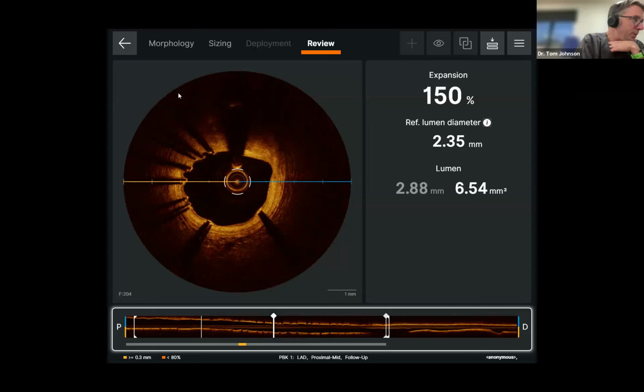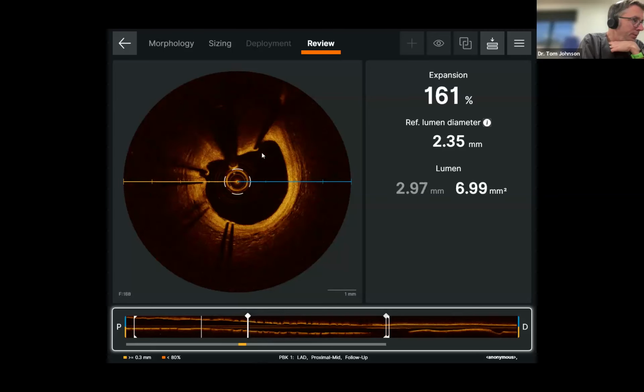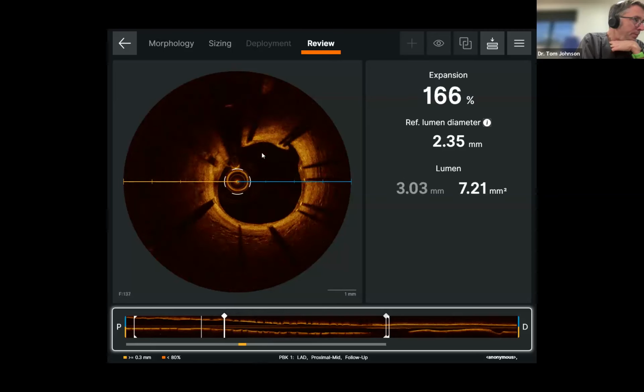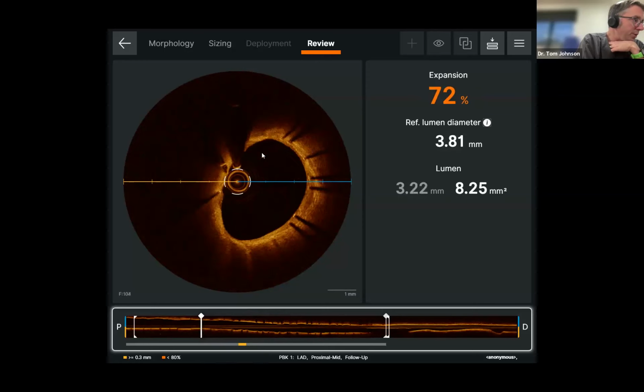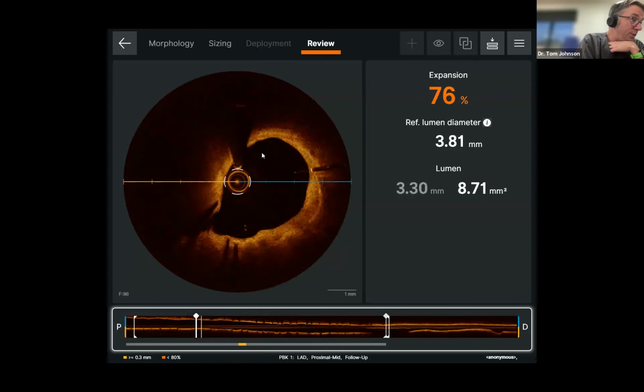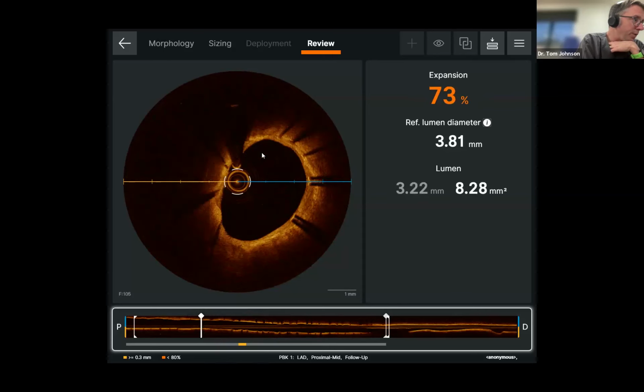And then here we see the double layer of stent struts. And so again, this is in an early phase of healing, just within 4 weeks. Here's some further malapposed struts, but actually with what appears to be tissue adherent. And we come up and have a look. There's the bifurcation that we have post-dilated into, where there was all that material, and that material has now cleared. So that's an important consideration from the before and after.